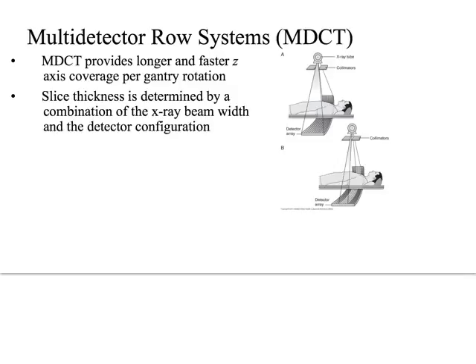So let's pause for just a little bit on that discussion and talk some about MDCT, or what I just call CT. She calls it MDCT because when this textbook was written, there were still people scanning on single detector CT scanners. That is gone. There's no one doing that anymore. No one. The government didn't quite outlaw it, but said stop doing that.